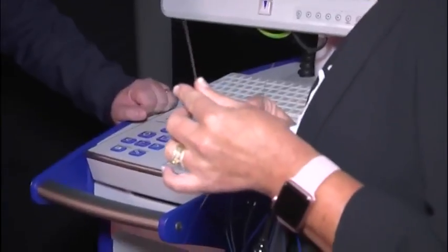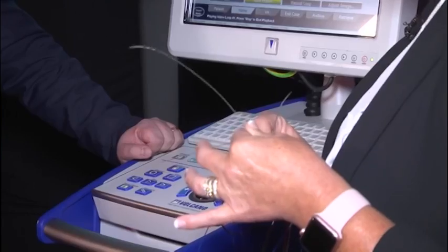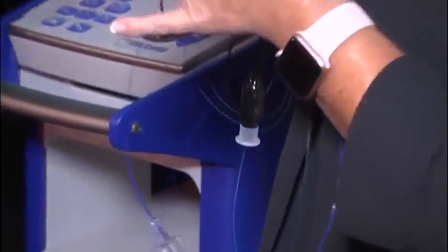Perfect, yes. What I have in my hand here is firstly a pressure wire for iFR measurements. iFR is a pressure measurement that we do inside the artery. Once you're on the cath lab table and they've done an angiogram, taken a picture of what the right or left coronary arteries look like, they would put this pressure wire with a pressure sensor past the lesion, the area where the narrowing is. They'll do a pullback, and this system will give them a single measurement.